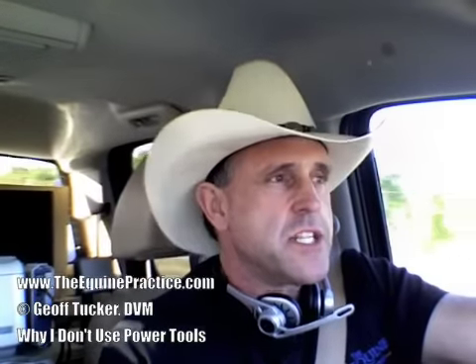Especially when there's another way, an alternative way that has been proven over time to be much safer and just as effective. So when I'm asked, gee doc, why do you carry a bucket of tools? Why aren't you setting things out on tables and hanging heads and drugging horses to the almost falling down? Why don't you do this? Well, the answer is I've just heard all the horror stories.